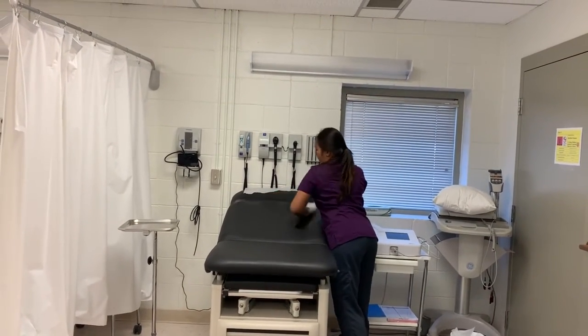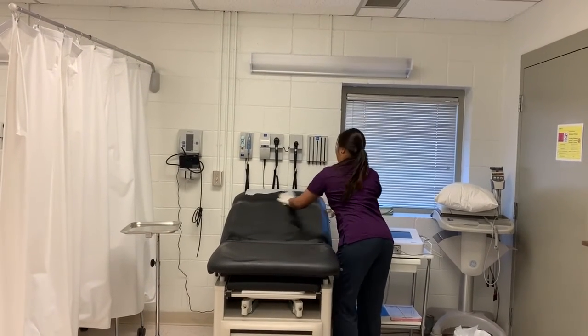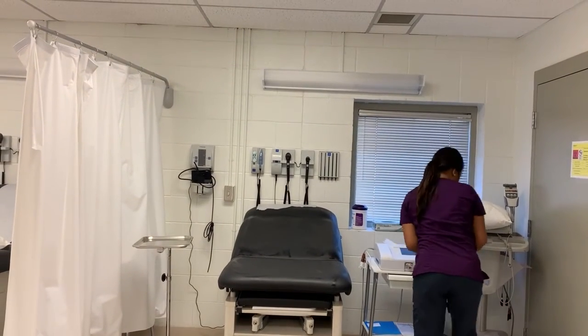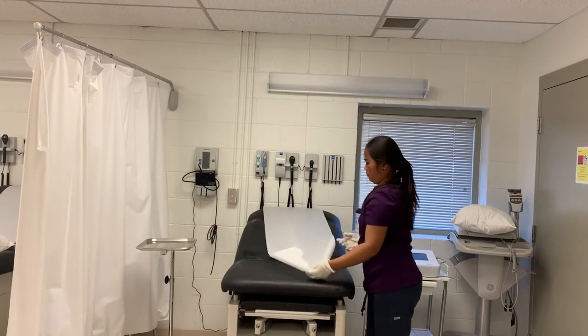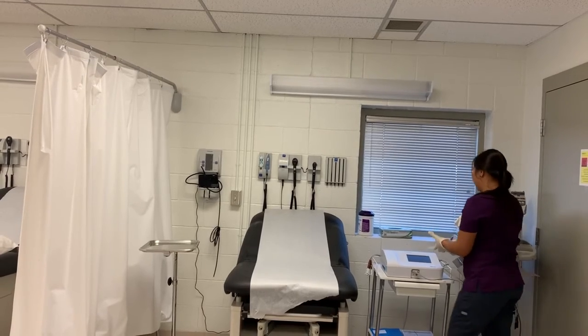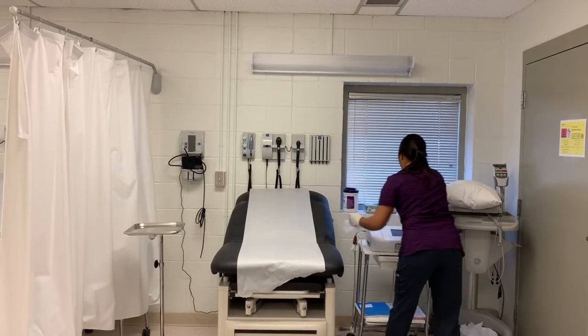I'm going to clean and disinfect the exam table, and I'm going to disinfect the machine and the big wires.